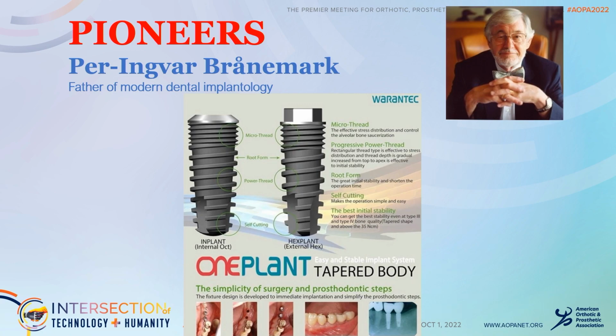He started actually with dental implants. That microporous feature in the screw implant that you all know is happening in dental schools and dental practices throughout our country was the beginning of osseointegration. And what happened when that started? They started putting those in, they were failing all the time, and then over time, the devices and the surgical techniques improved, so now it's being done literally right around the corner from my house.